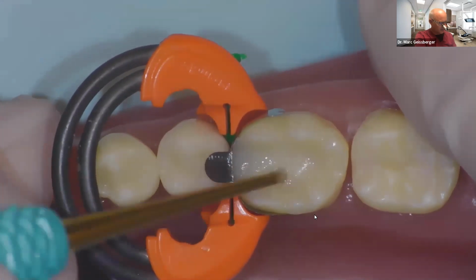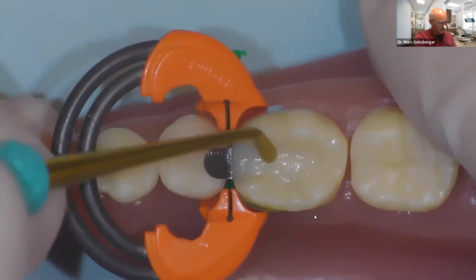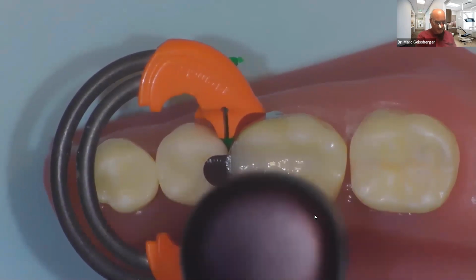So if you notice, I spent a little time burnishing this, and this is what prevents voids. And it really helps eliminate those. So now what I'm going to do, that's nice and smooth, I'm going to cure that again. So that's going to be a 10-second cure. If I were sitting in my chair, I would be cutting off the composite right now, but I don't have that luxury this evening. So I'm going to cure that.